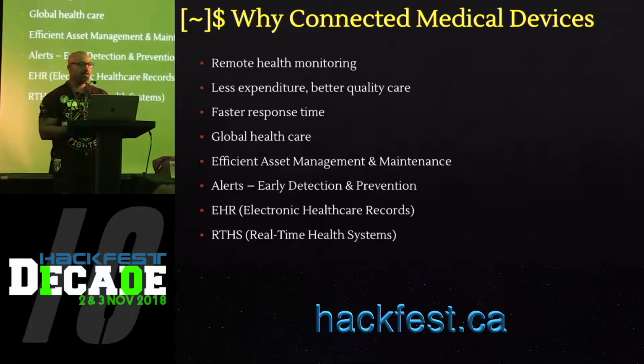One of the other things we were able to do through packet manipulation was gain access to something called the master drug list. Remember how I talked about doctors being able to set soft and hard limits on the dosage, like 100 milligrams of morphine being the upper limit? All that data is stored in the master drug list. We weren't able to confirm this because we didn't have a real pump server in our lab environment, but there was a strong indication that you can manipulate that data, push it back to the infusion pump, and overwrite the master drug list. In that case, it should be pretty fatal. So these are some of the findings that we found in the infusion pump.